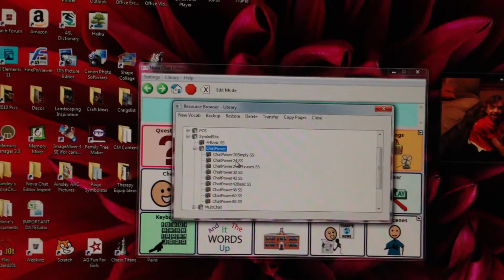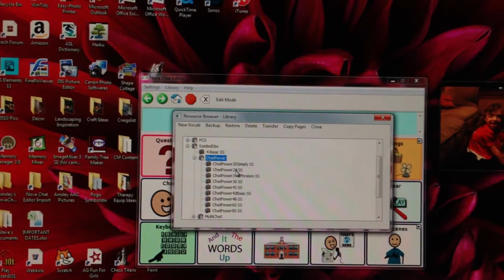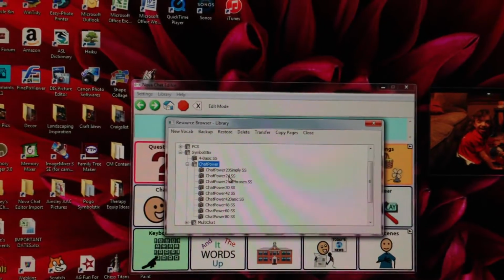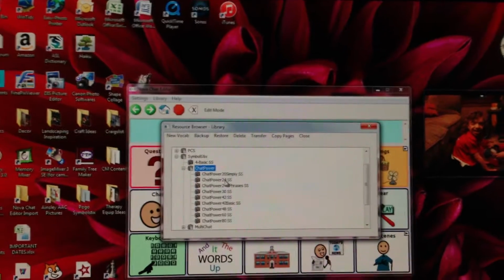I've since figured out that I think they were misinterpreting what was going on. I think she was picking a button that was not the correct button, but not because she couldn't get to the right button, but because she didn't know what the button was. So those are two different issues.